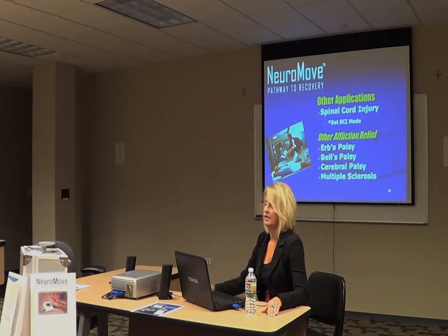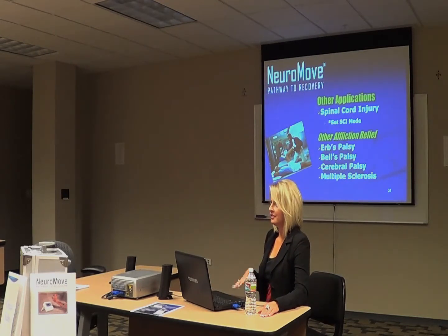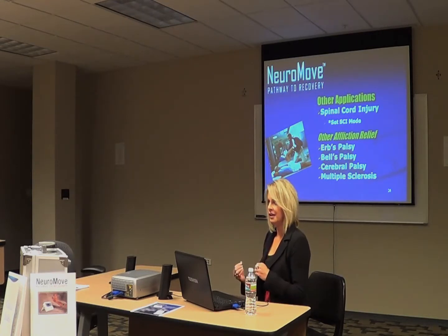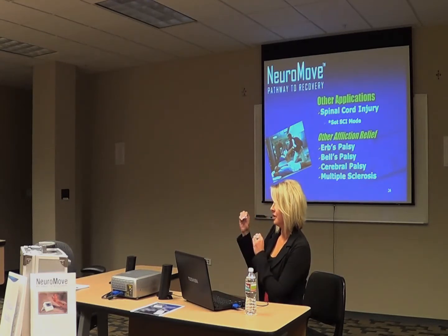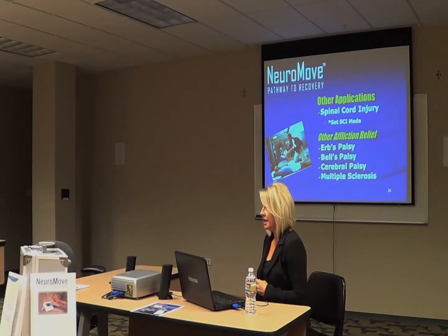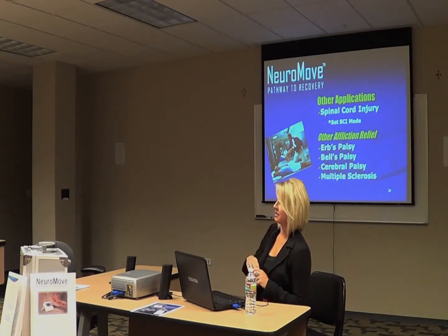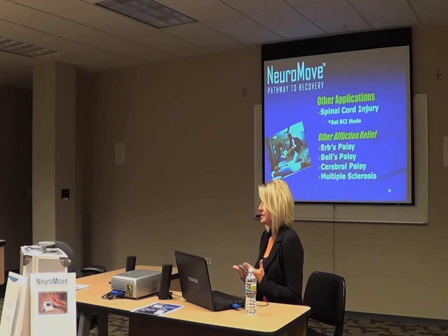I always tell therapists, if you have a patient who's been labeled a complete, just as a therapist, put this device on them and see if you get a signal. Because if you get a signal on a patient that's been labeled as a complete, what does that say to you? They're not a complete. There might be some small hope for them to have some kind of movement. Are they probably going to walk again? Probably not. But if you give that patient some kind of freedom to maybe move their fingers a little bit, or whatever it is that you can do with them, they don't have it right now. So that's good.